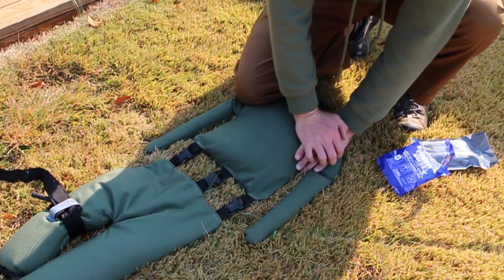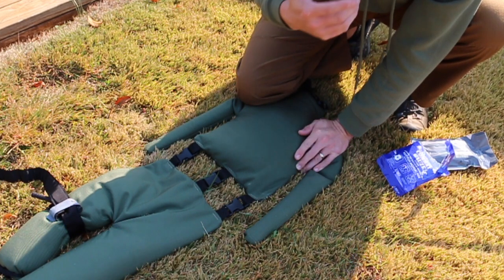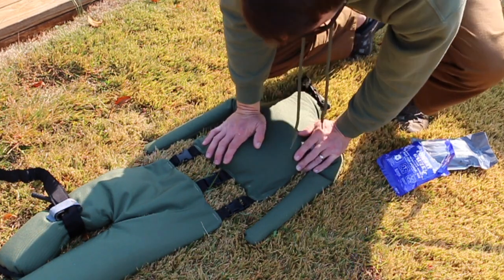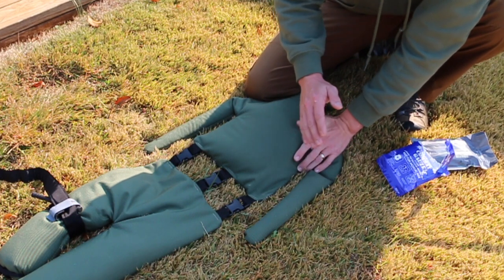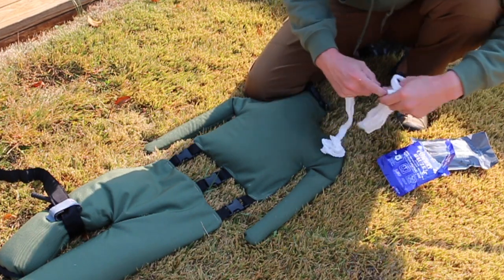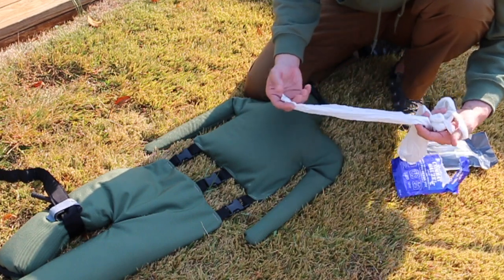So firm, direct pressure, put all your body weight here to hold it. Make sure you can get in there. Now, normally we don't remove gauze once we try to put gauze on here, but for the sake of the hemostatic agent, they recommend that if you hold pressure for 3 to 5 minutes, you still get some bleeding coming through here, then they recommend to pull this back out and to repack it, either with some fresh combat gauze if you've got it, hopefully.